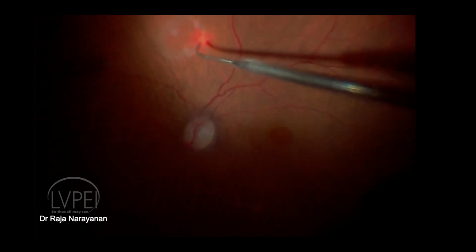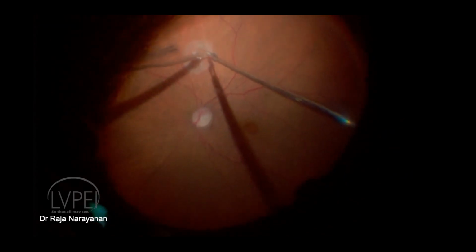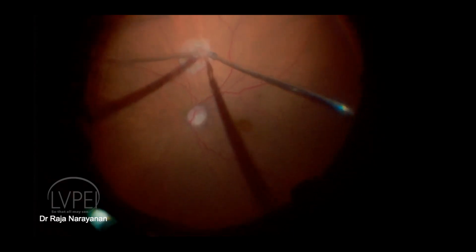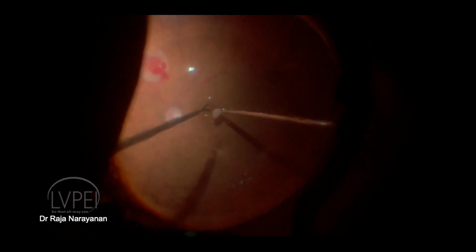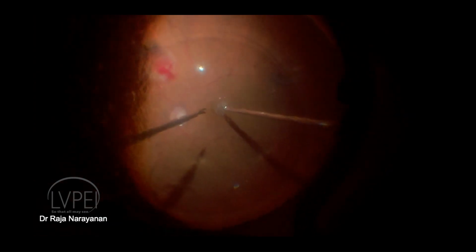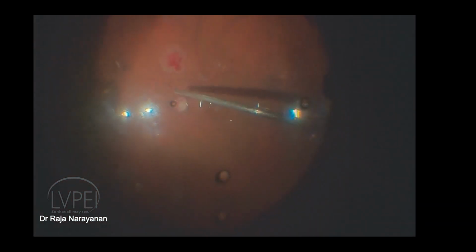The donor site was well lasered, and the graft was excised bimanually under chandelier illumination and positioned at the macular hole under PFCL cover. A complete fluid air exchange was performed, and this time we went the conventional route and injected 1000 centistoke silicone oil.